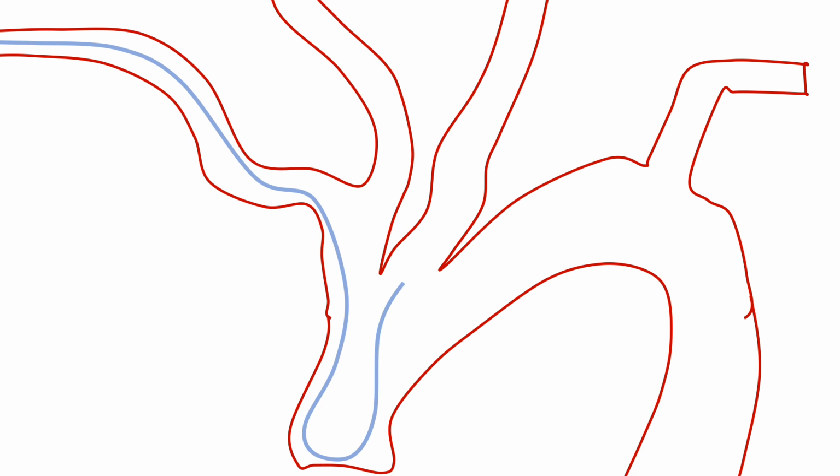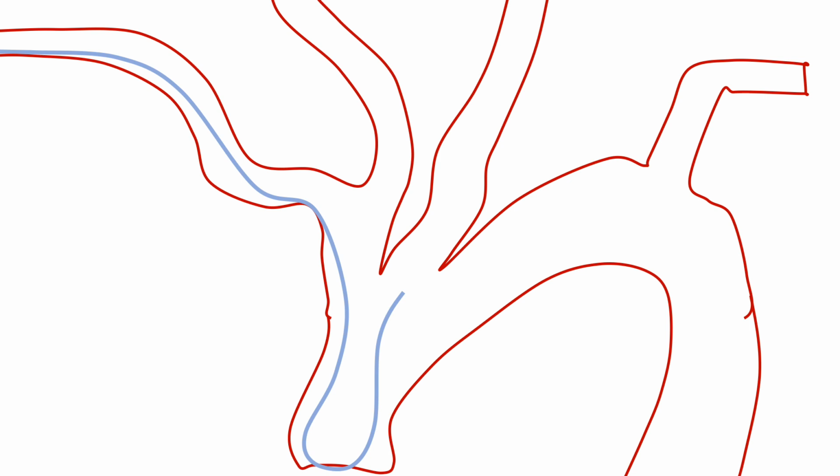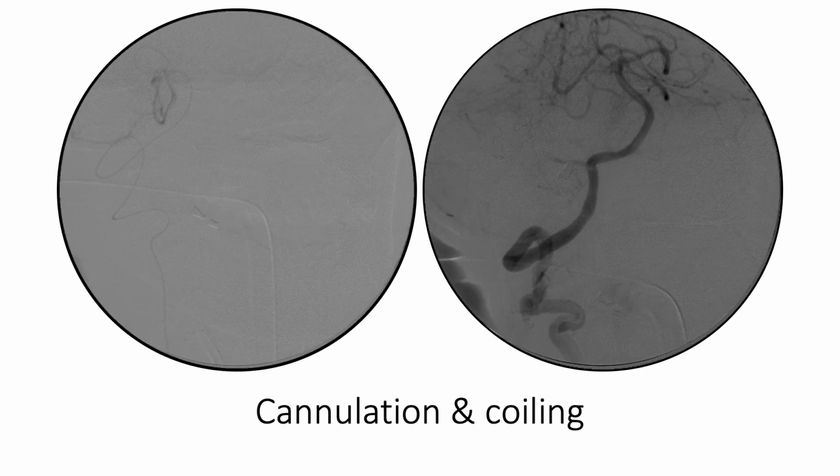Your Simmons 1 is here. You pull it, it enters into the left carotid, bring it, rotate it, and you enter into the right carotid artery. Have you got that? The same thing can be done to enter the vertebral artery on the left side. So these are cases with very tortuous anatomy, coming from the arm. It's not a difficult challenge. For the vertebral arteries, it's excellent.